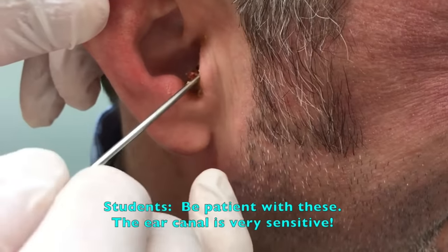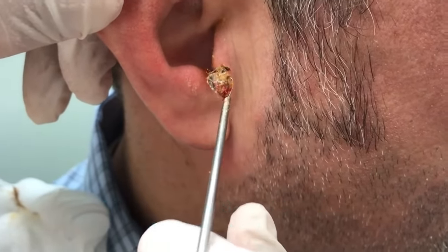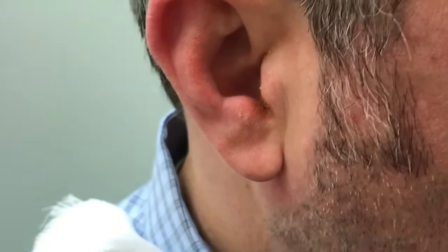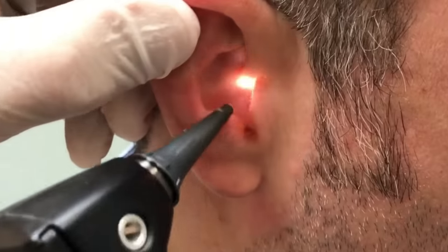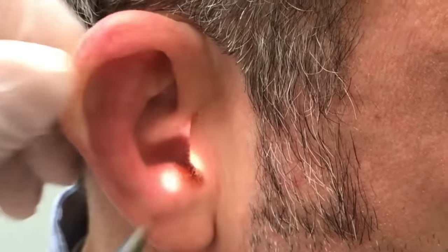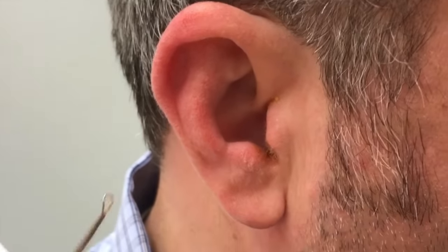Oh my. That feels better. Look at that dude coming out of there — that's huge. We just got another huge one — that's huge too. You're clear now. I want you to see what came out of your ear there. Wow, look at that.